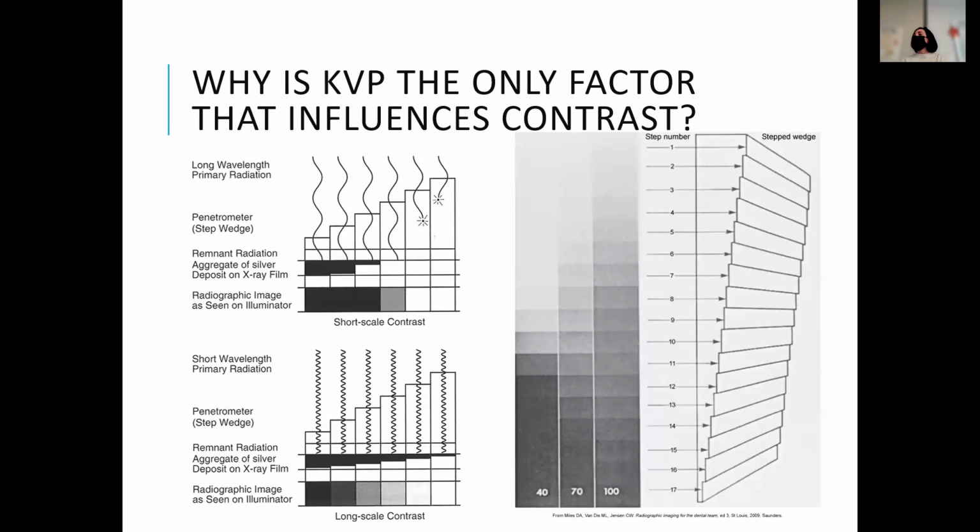So your low KVP has gone through this easy thin area, then this thicker, little thicker, little thicker. It's all black. We get a tiny bit of variation of gray here, and then it just goes to white. And then it's done. That's as much as it could give you. It couldn't give you any more information than that.